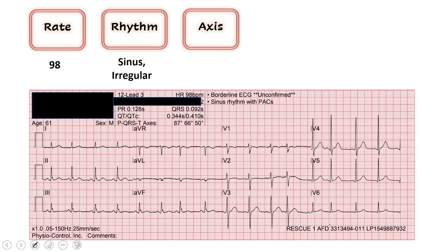Moving on, as we look at our axis, the leads we're most concerned with are leads I and AVF and the direction of the QRS vector in those leads. Lead I is mostly up — that's our left thumb, we're good on the left side. AVF is our right thumb, mostly up here. I have two thumbs up, which gives me normal axis deviation.